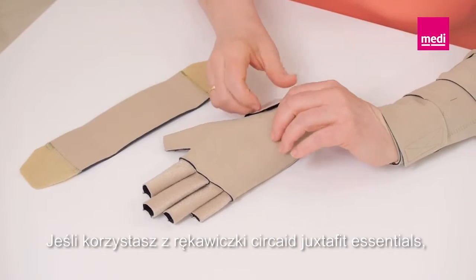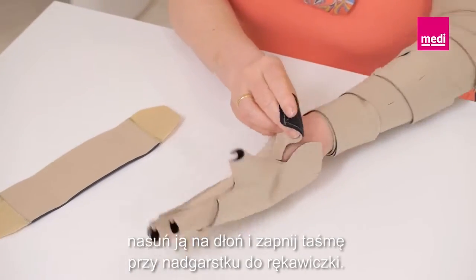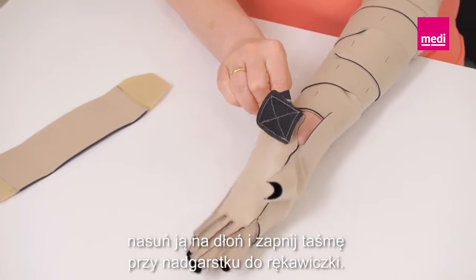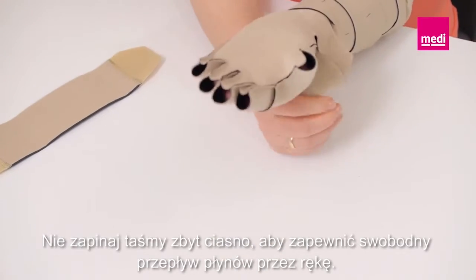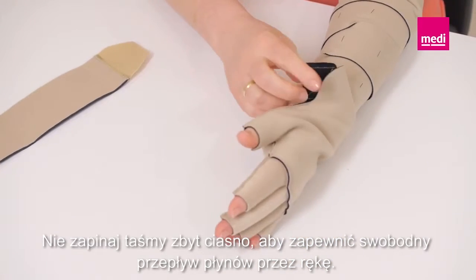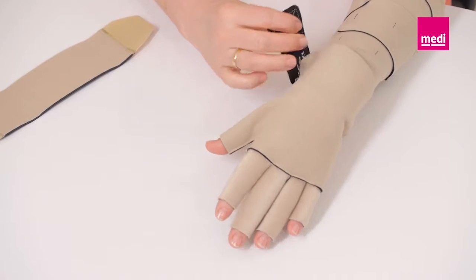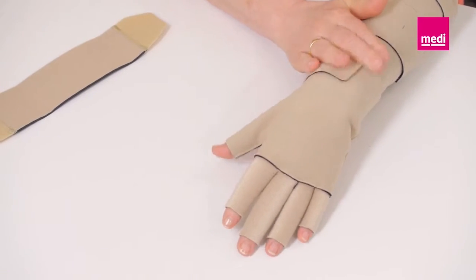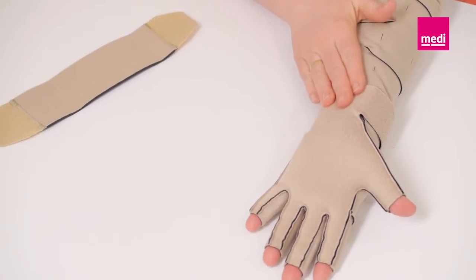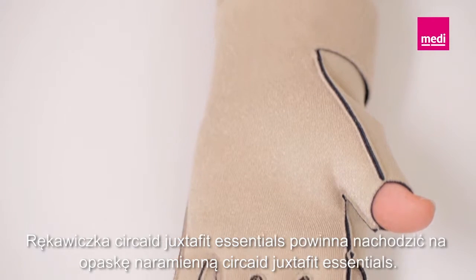If using the Circade Juxtafit Essentials glove, slide it onto the hand. Fasten the wrist band to the glove. Be sure not to over-tighten the glove's wrist band so that fluid can freely move out of the hand. The Circade Juxtafit Essentials glove should overlap with the Circade Juxtafit Essentials arm.